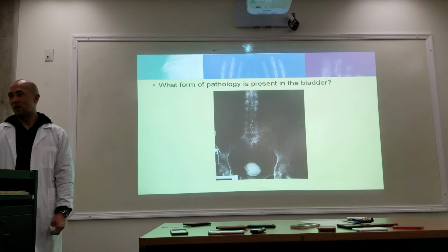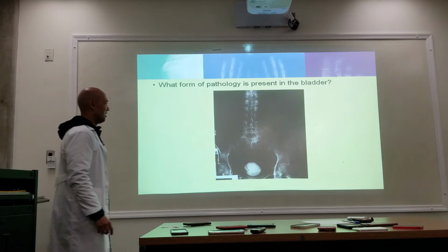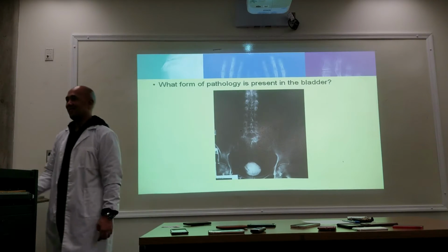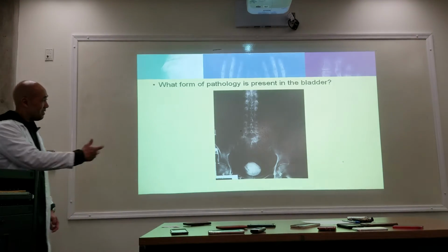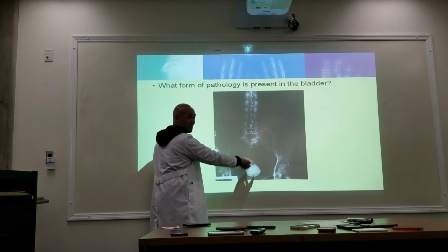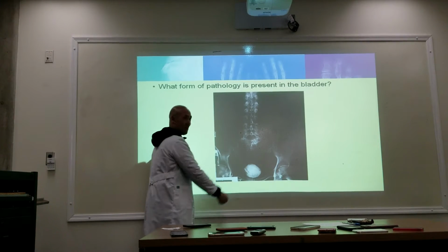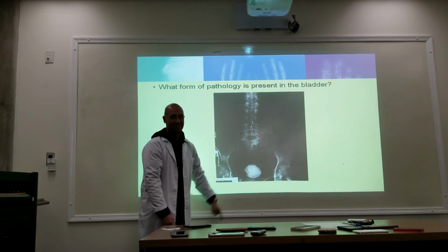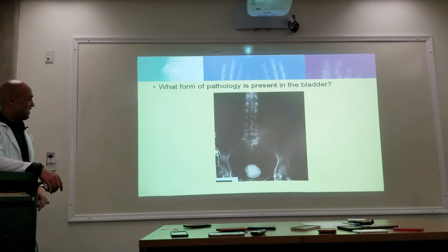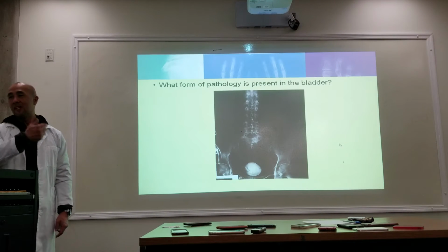First of all, the image is too dark, right? But what's obvious? Bladder is the only thing we can see. It's right here. That's a stone. That's a stone. I thought it was a bladder. Well, this is bone, right? It should have the same consistency. It's solid. Bone is white. It's a lot lighter than bone. Well, I thought it was obvious. Yeah, that's a stone. The whole bladder as well. So the stone developed in the bladder.